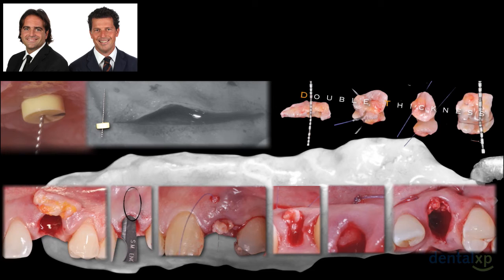It is a partial thickness flap. We do a simple envelope. Remember, it's a partial thickness flap. That is very important, not a full thickness flap. And then with a U suture you can get the tissue inside the socket, inside this little envelope that we created, and then you can just close the suture, and you have your connective tissue in position.